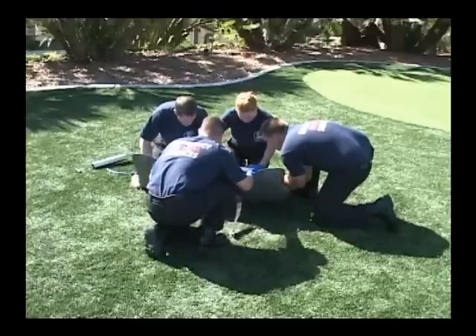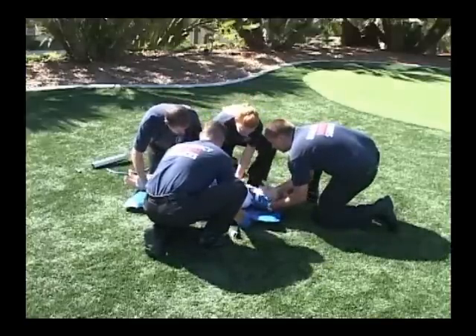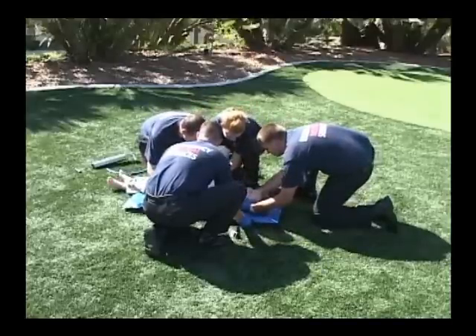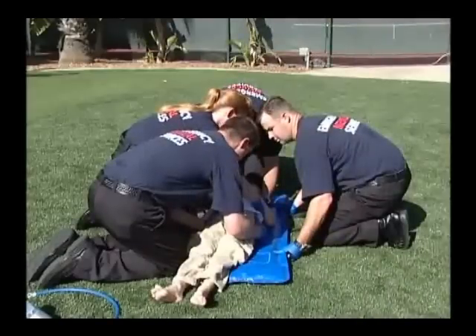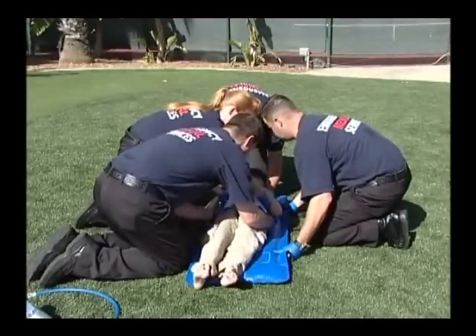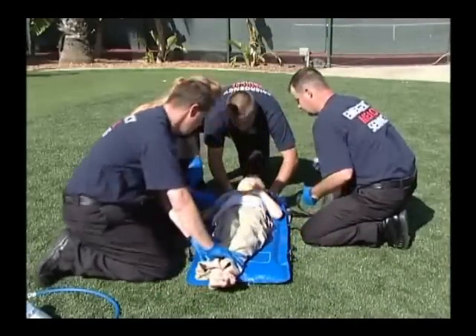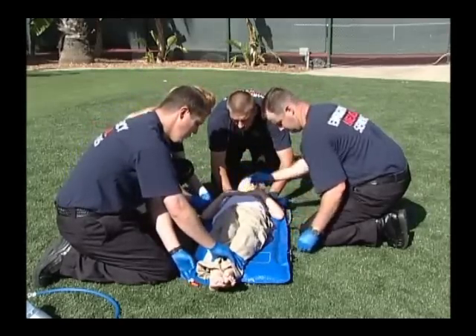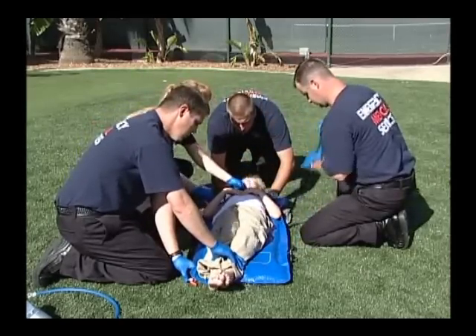The injured child should be log-rolled or lifted onto the vacuum mattress in accordance with the procedures established by your local EMS medical director. Once the child is properly positioned, the straps can be secured and the mattress evacuated. Care should be taken to minimize any movement of the patient during the application and securement of the vacuum mattress.